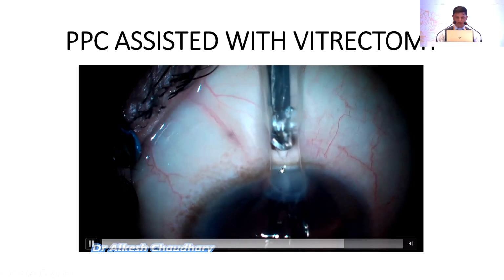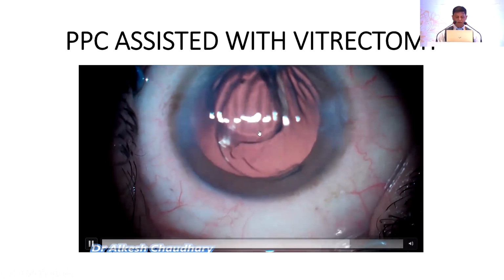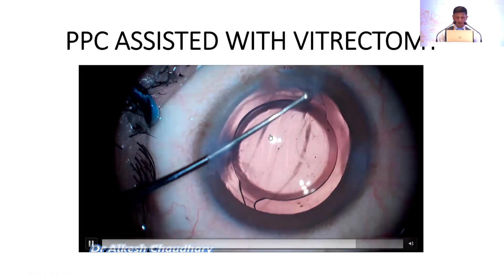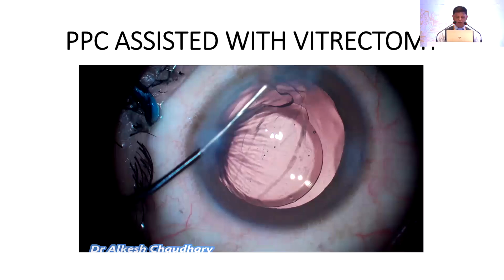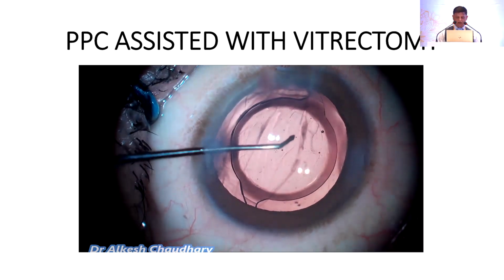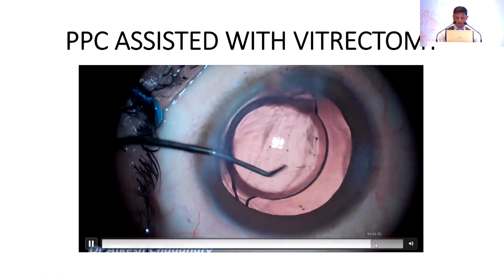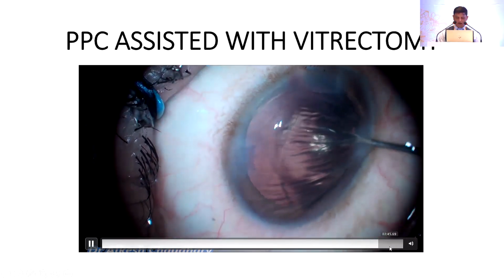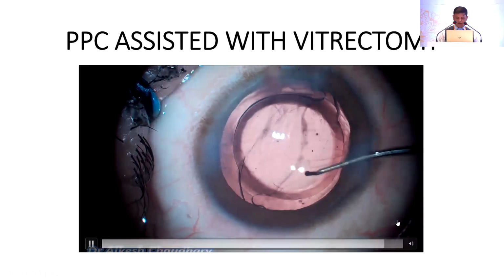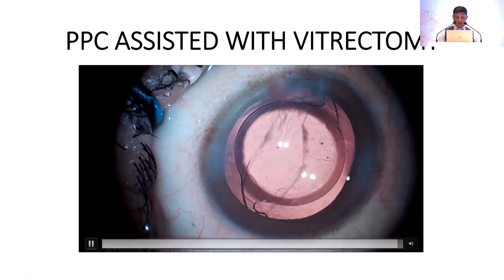Now, after injecting viscoelastic, this is again a DOF lens that we put in the sulcus with an optic haptic capture. See, we do minimum rotation of anything, just place it in the sulcus and do optic haptic capture. So that lens is stabilized, doesn't move, and so this surgery is over.